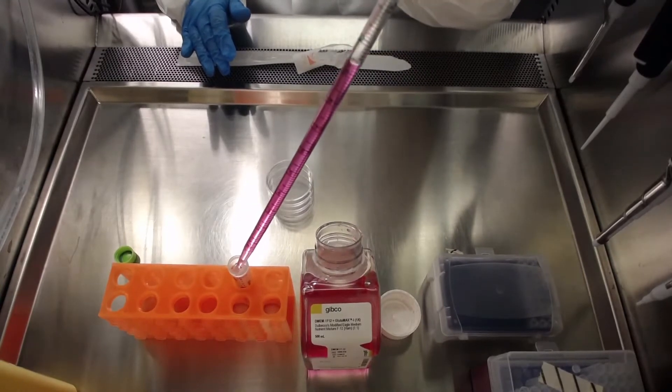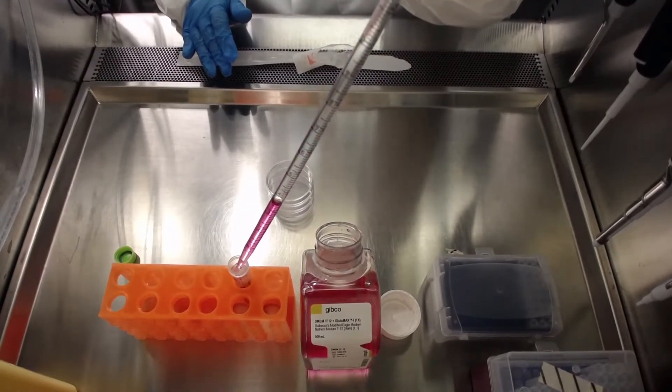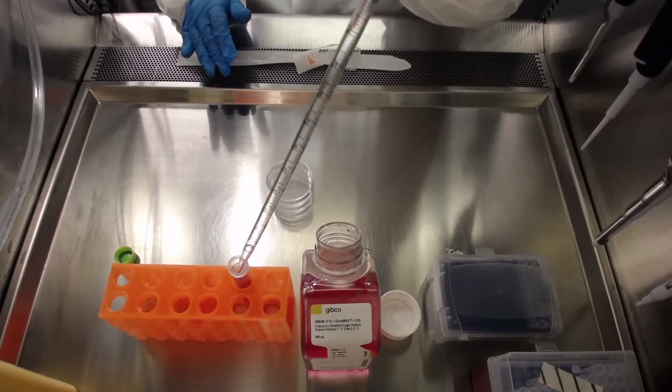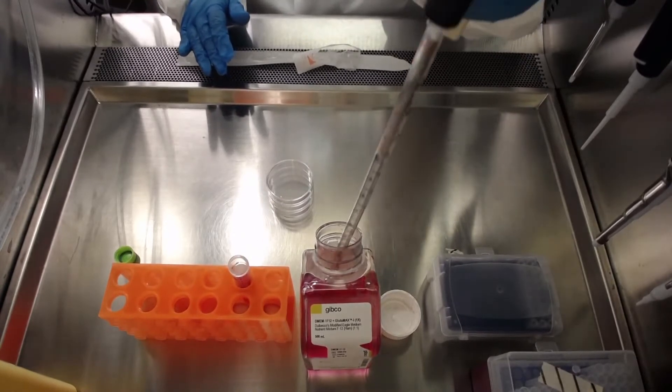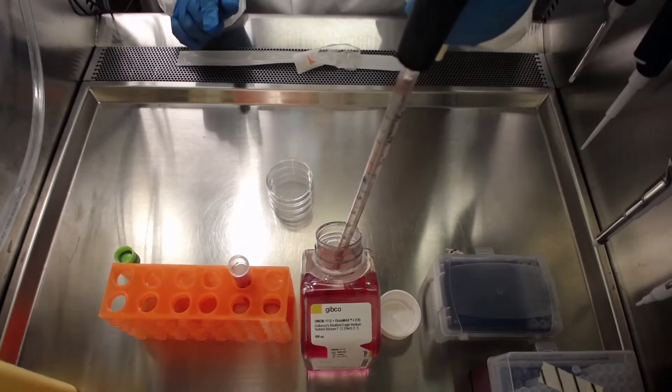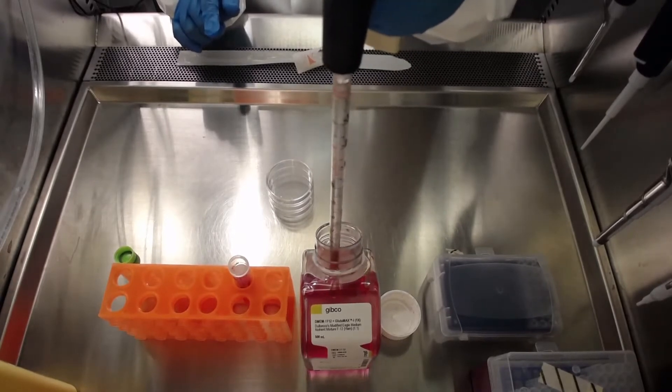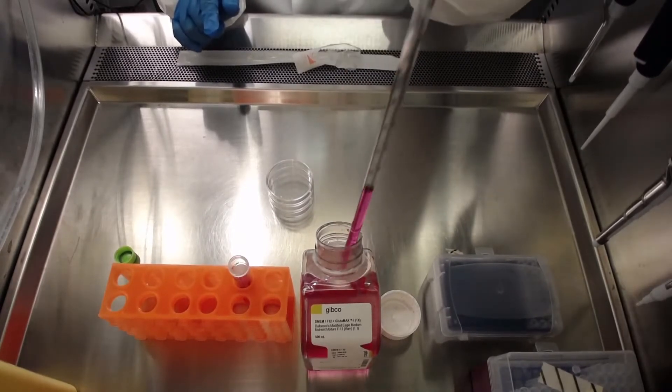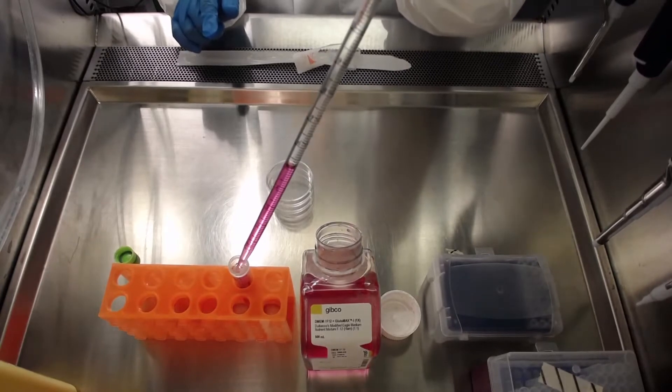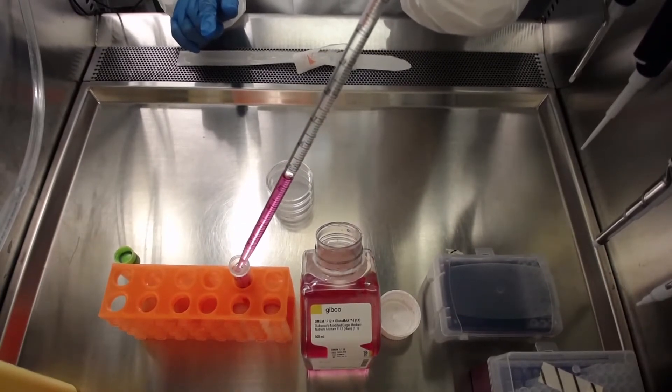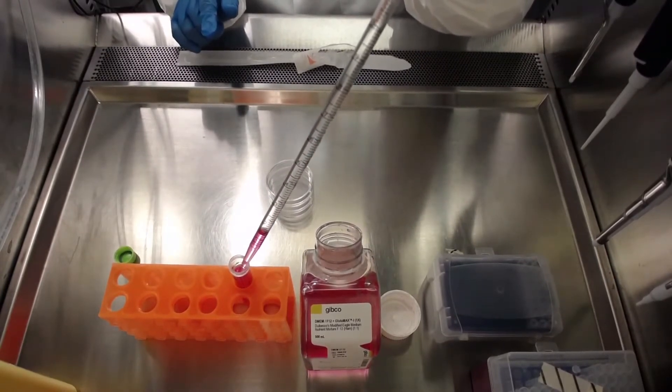If using more than one aliquot, you can pipette the media in an adequate number of tubes and place them on ice to make sure the media stays cold. It is important to dissolve matrigel in cold media to avoid polymerization inside the tube.